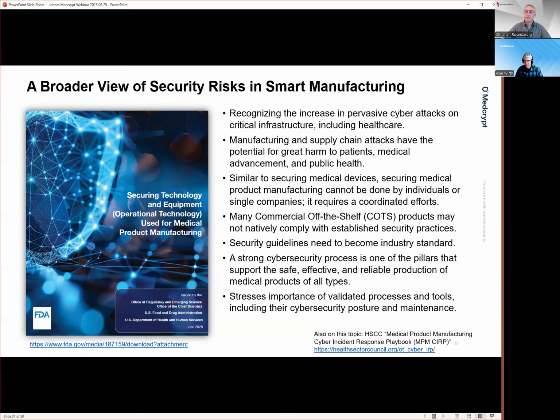And this concern is not limited to just software-based products, right? Even non-software products, consumables, or even pharmaceuticals can be affected, as we, for example, saw in 2017 when a large pharmaceutical manufacturer's production environment got taken down by the NotPetya virus, and that actually led to shortages of pharmaceuticals and vaccines globally until that, again, manufacturing environment was restored.